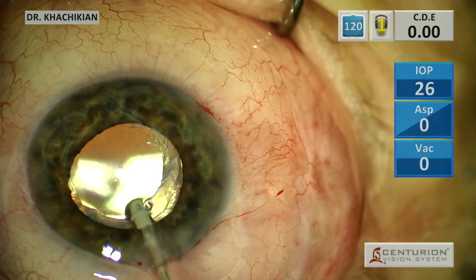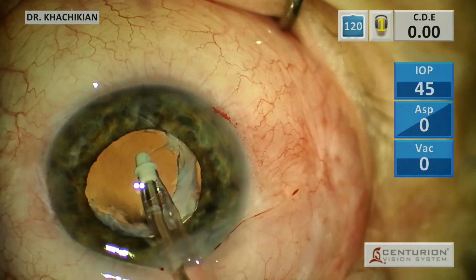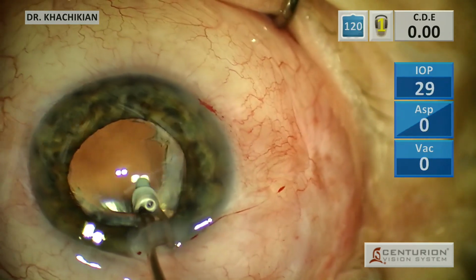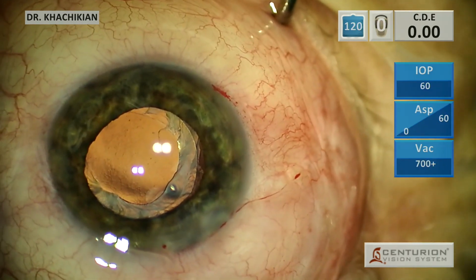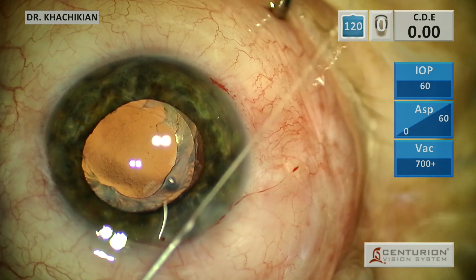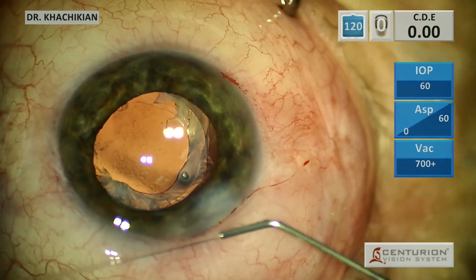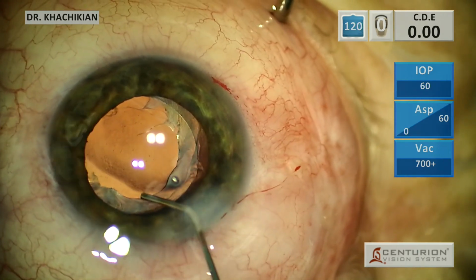I think intracapsular fixation is the best. If the lens does dislocate, we can always fixate using that capsular tension ring. So I think that is very good. And we will seal up our incisions. Work on calling it a day.